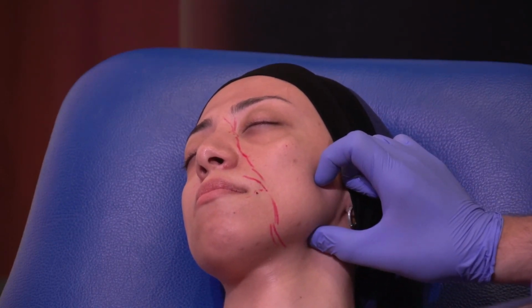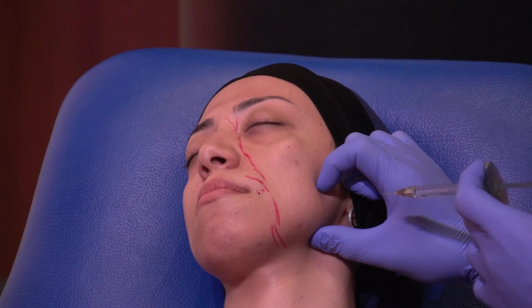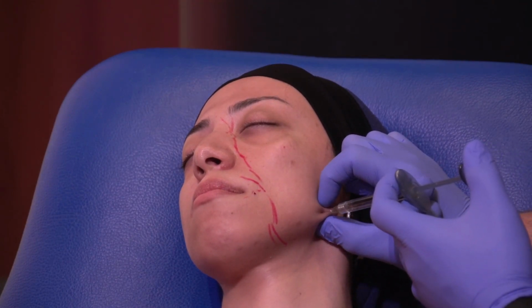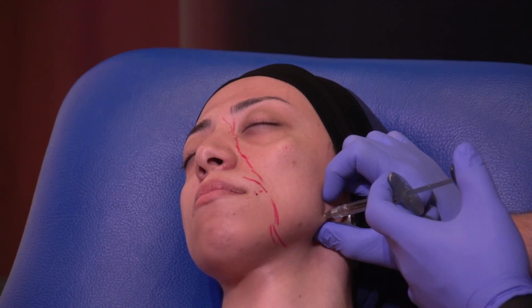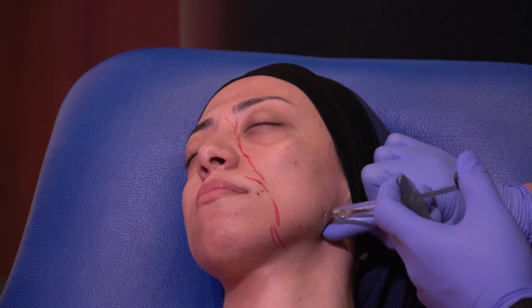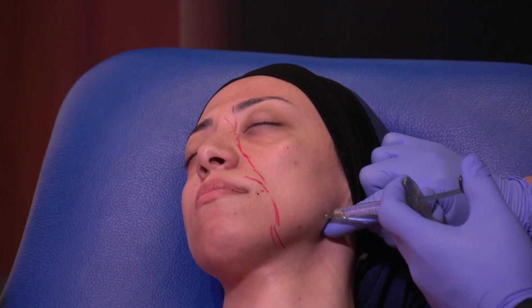So at the angle of the mandible, I've not touched the areas I've sterilized, I identify the angle, and go directly all the way to the bone. The patient might feel this injection in her teeth. Okay? I tell her that's fine. If you tell her, she'd feel much better that you're not doing anything wrong.